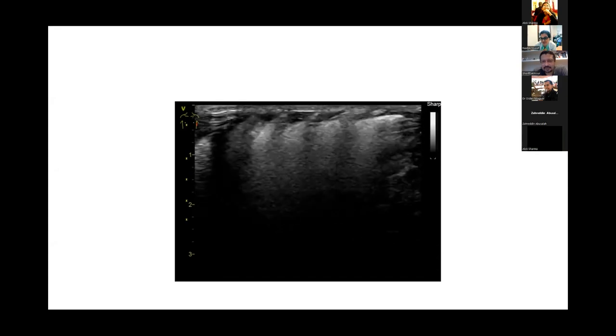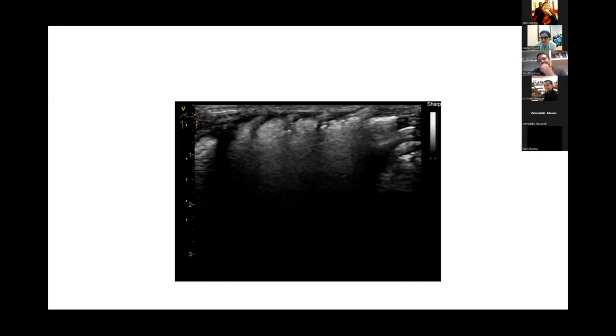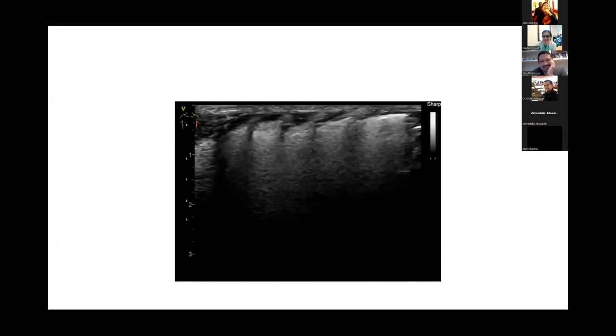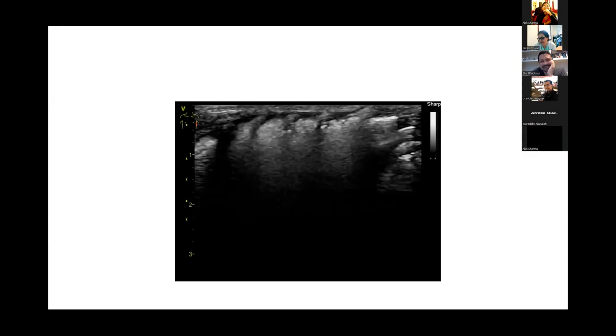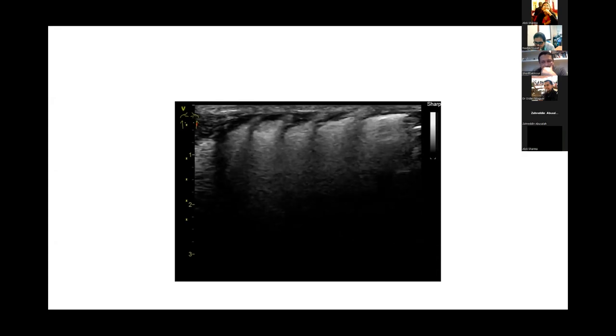These are just artifacts. So changing the frequency will not help you. This is not real. This is in our heads. Okay. So, yeah. Consolidation, yes, but the artifacts, no. You won't get any additional information. Okay.